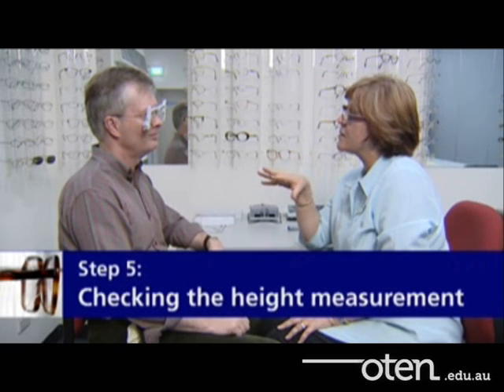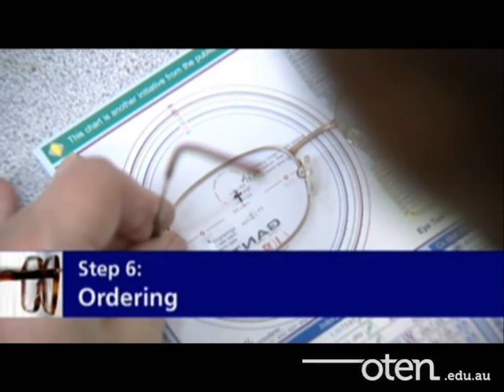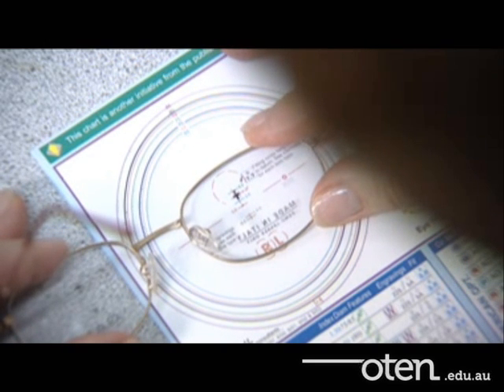The dispenser needs the client to relax to ensure that their posture is natural when being measured. They may be sitting up straight and not in their natural position. The dispenser does this by engaging the client in conversation while continuing to note the positions of the markings. I'm just going to check now John that these lenses are suitable for these frames. Order the lens position according to your monocular PDs and the heights according to the final position of the marking. The height should be measured relative to the deepest point of the lens at the peak of the bevel.